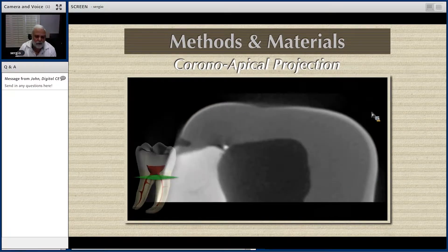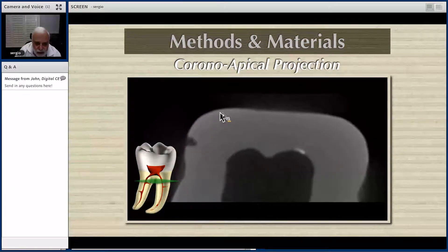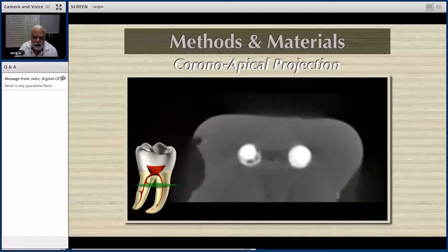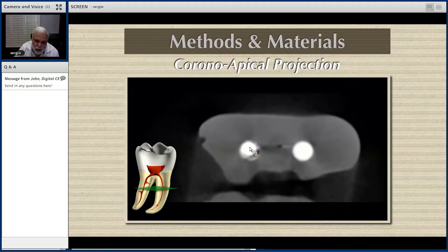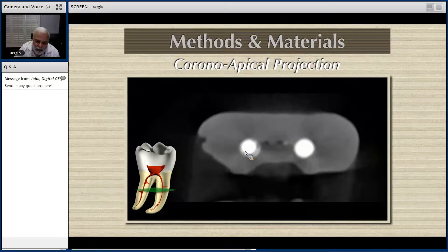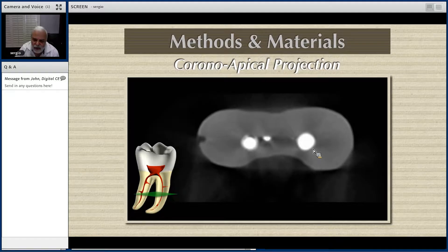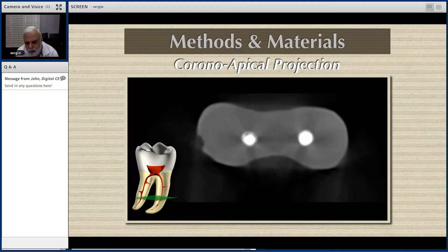Let me show you the coronal-apical progression. This is where the section is. Here you are going to see the single cone technique and here you see the core obturator. On the single cone, look at all the voids — the cement and all the voids. And zero voids right here — zero voids on the core obturator material.